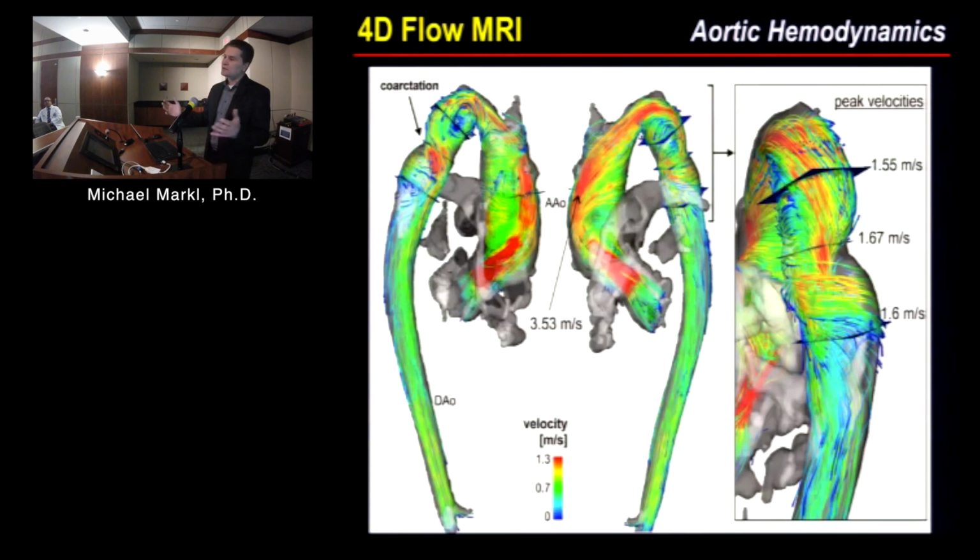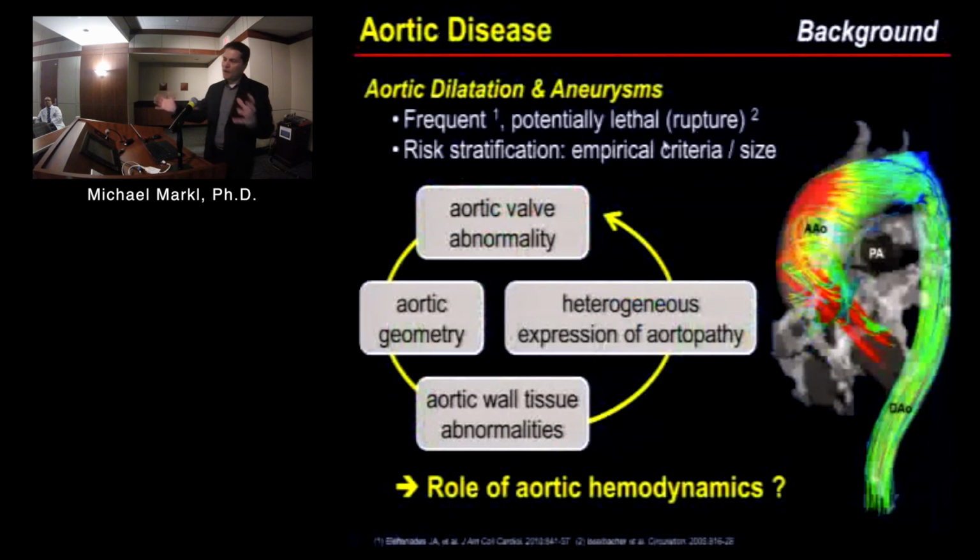But this technique, although the scan time is relatively long, has the advantage that you deploy a 3D volume that covers the entire region of interest, and then you can go back retrospectively in the data and quantify at any location of interest. So I want to now move on and talk a little about how we can use this.